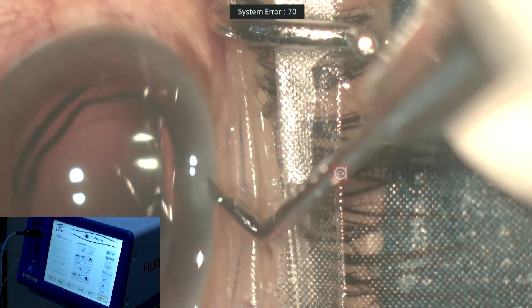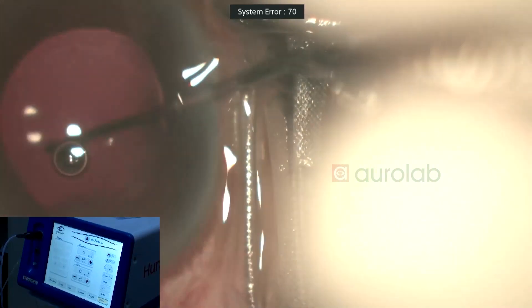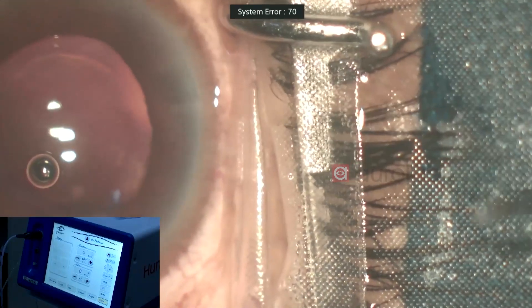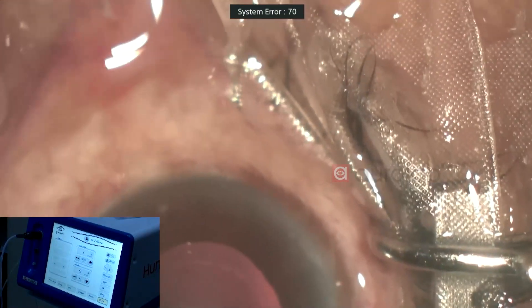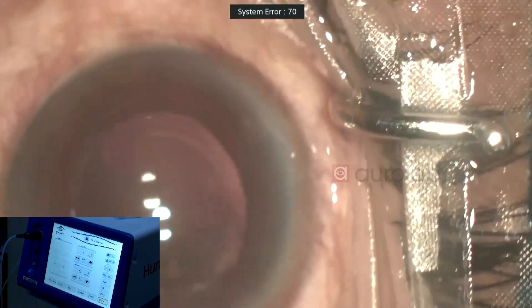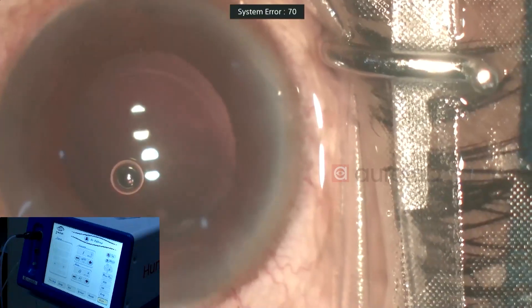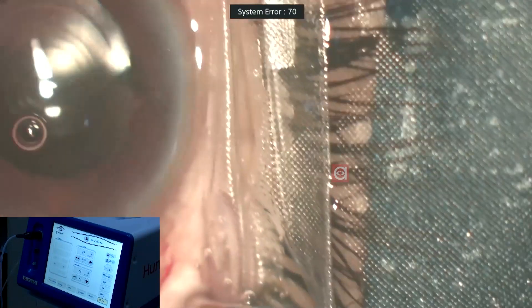I'm just dialing the haptic into the bag. The rings are pretty much visible now. We have a good overlap of the optic with the rhexis edge.